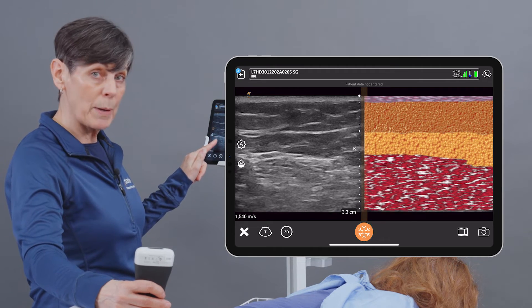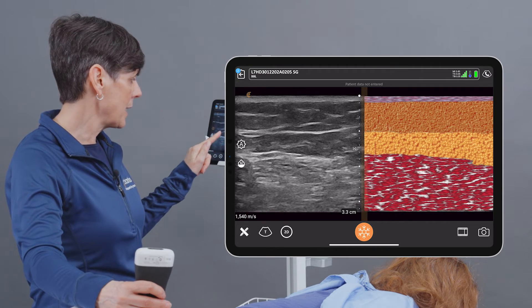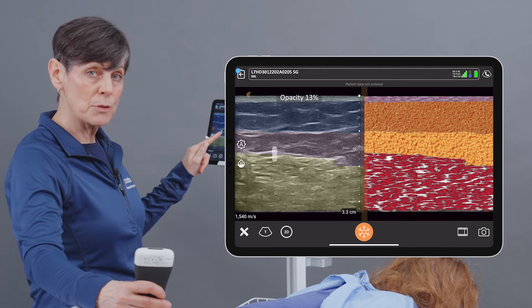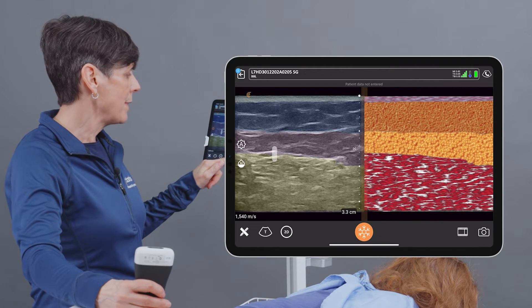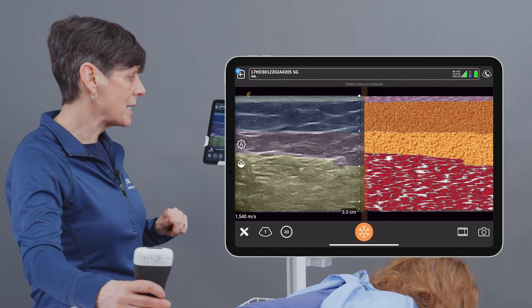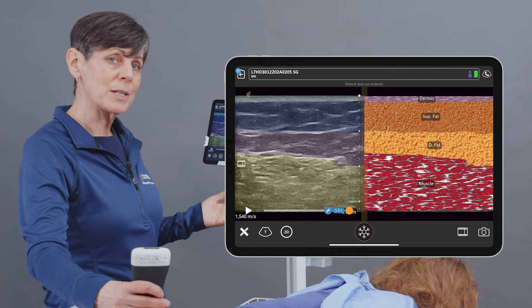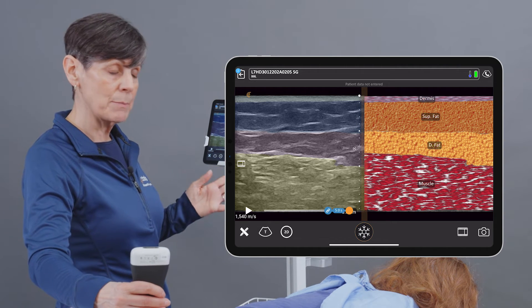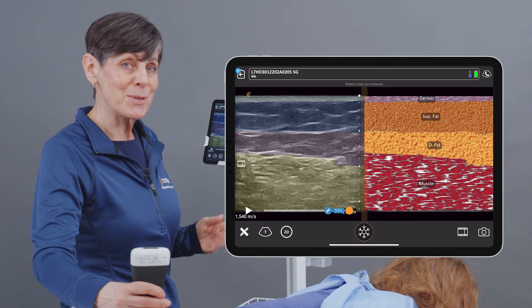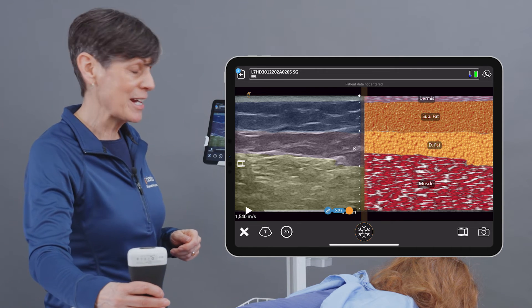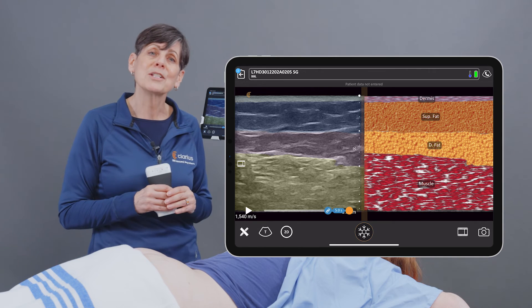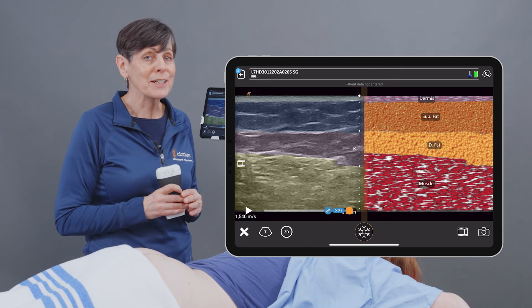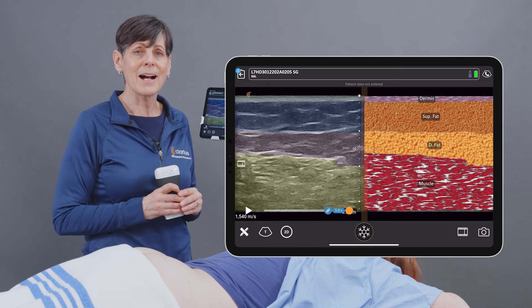Now I can adjust the opacity of my grayscale image if I like, and that's to the user's preference. And then once we freeze the image, we get an added bonus of text labels on top of the anatomy. So it's like having an anatomy book right before your very eyes. There's no need to be intimidated by ultrasound imaging. Have fun learning ultrasound with T-Mode AI.